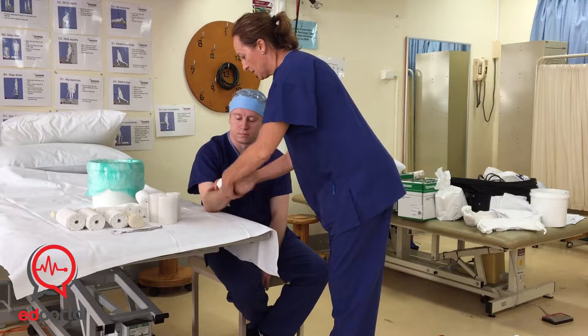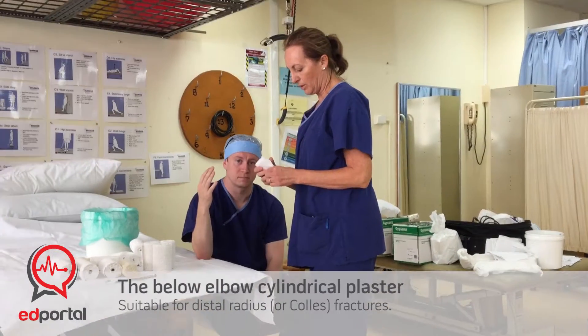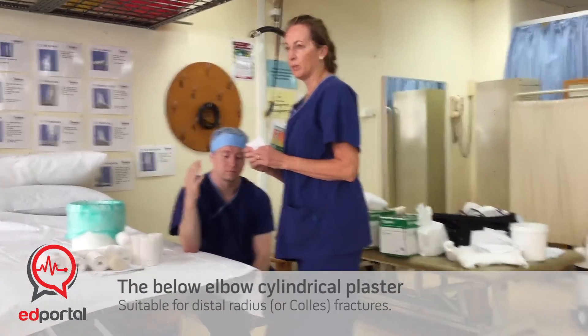Get your patient to sit with their arm up like they're going to arm wrestle you. I'm going to start with a full below-elbow cast.